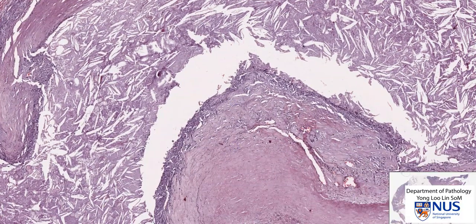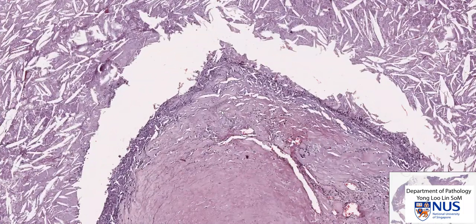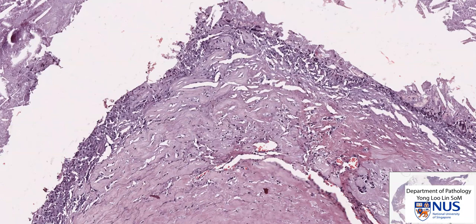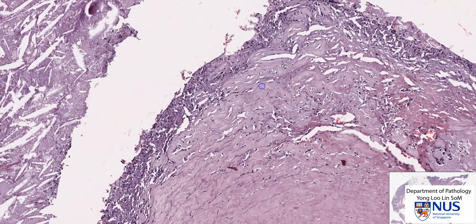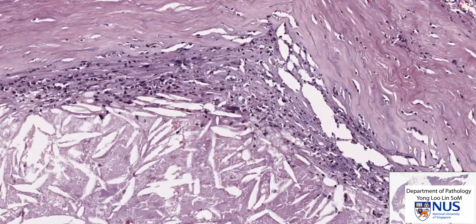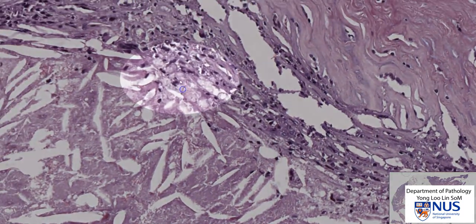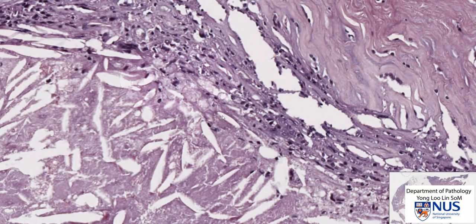This is part of the fibrous cap of the atheroma, and this is composed of fibroblasts, some inflammatory cells, and sometimes we can also see smooth muscle cells. In some areas we can just make out a few foamy cells — for example, over here we can see some macrophages with abundant bubbly pale lipid-rich cytoplasm.